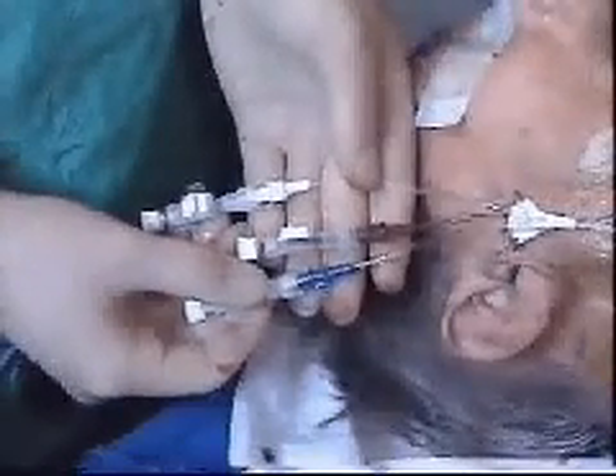Finally, the line is flushed by removing the cap, applying the syringe, aspirating to confirm venous access, and flushing through with heparin saline. The catheter is now in place to allow monitoring and infusion therapy.